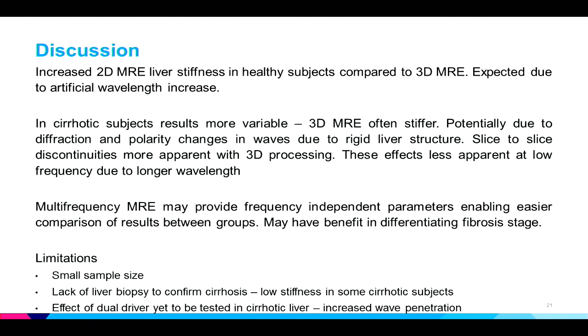Another thing is that in cirrhotic livers, because it's stiffer, the waves penetrate deeper into the liver. And so we want to do the dual driver experiment that we did on the healthy subjects in cirrhotic subjects to make sure that we're not going to cause a change in stiffness depending on whether we're looking at single or dual drivers.